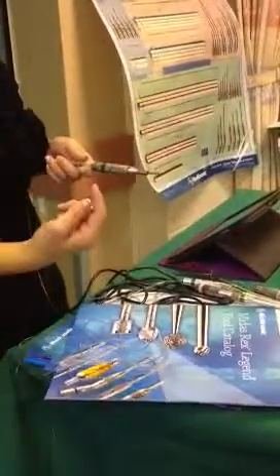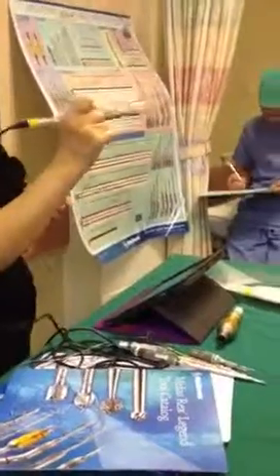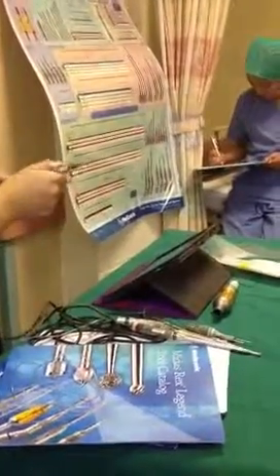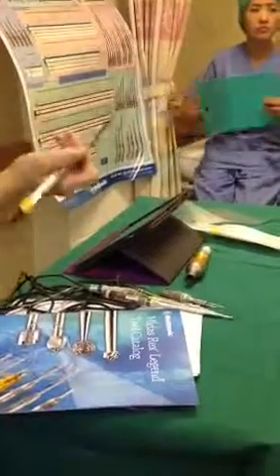The best is after you load the tools, you check. Always, before entering the patient, the surgeon has to step on the pedal to let the motor run. Test first. Test first. Just like I mentioned to them, when the staff nurse loads the drill bits down, the best is to let the motor run for a while. If you don't have 1 minute, at least run for a while.